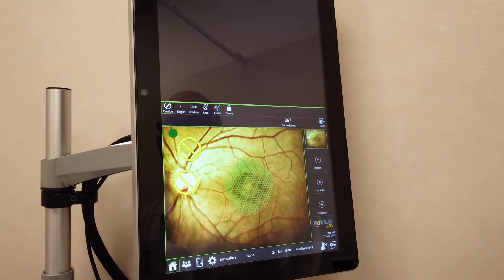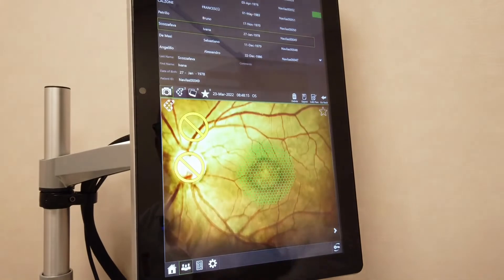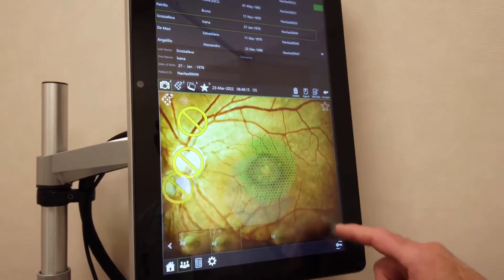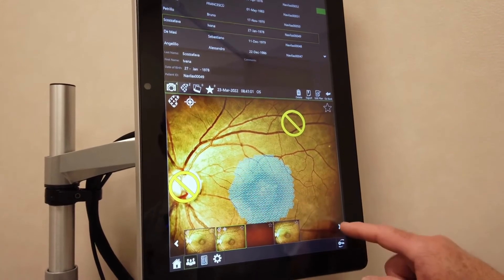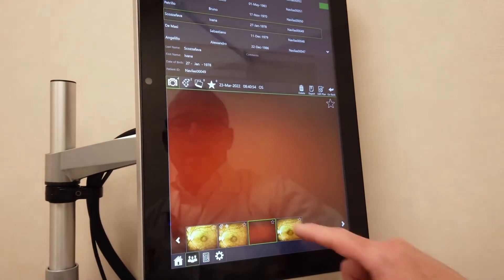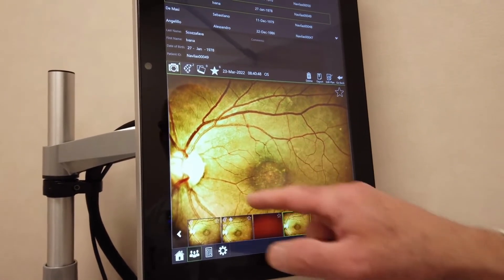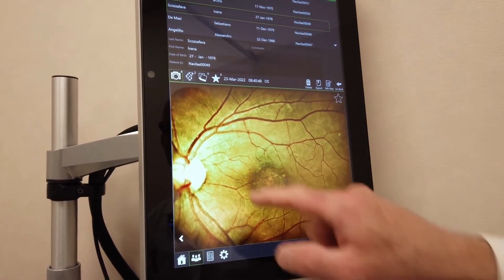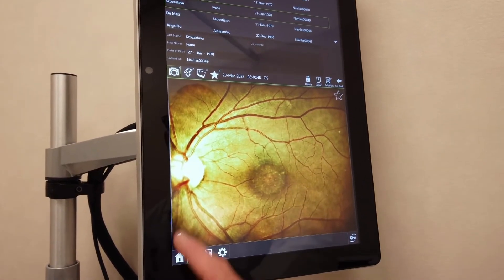At the end of the laser treatment, a picture can be taken to verify that a proper job has been done. This is the work that has actually been done, and this is the photo taken at the end to verify that no damage was done. There are in fact no spots on the retina, so no damage was done, being an obvious sub-threshold treatment.